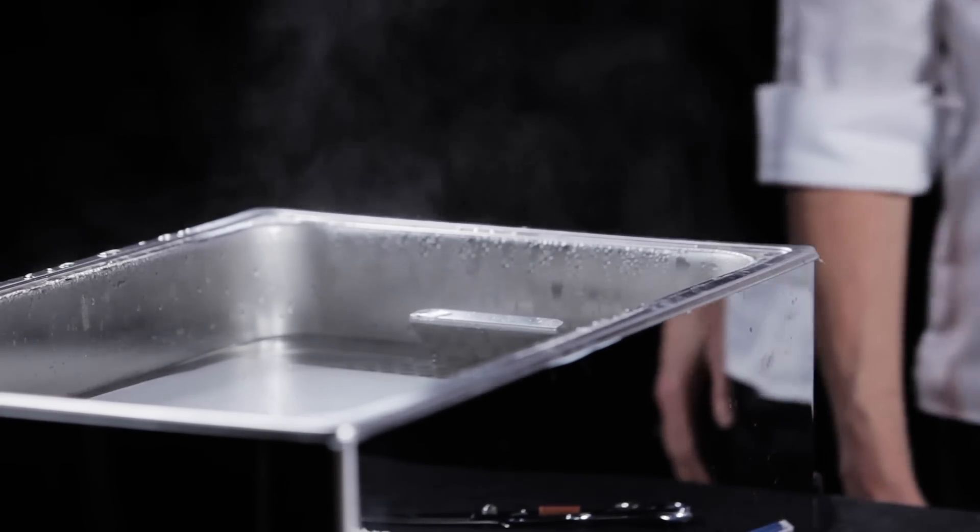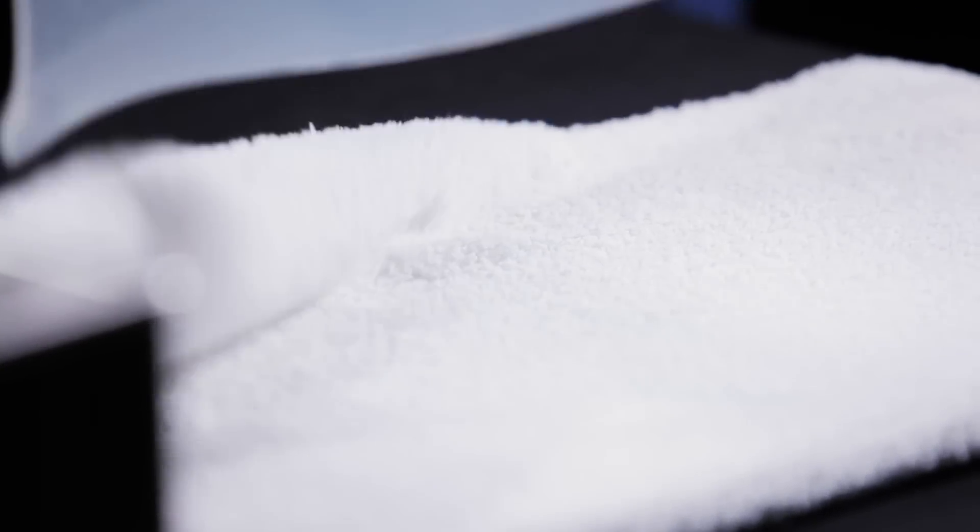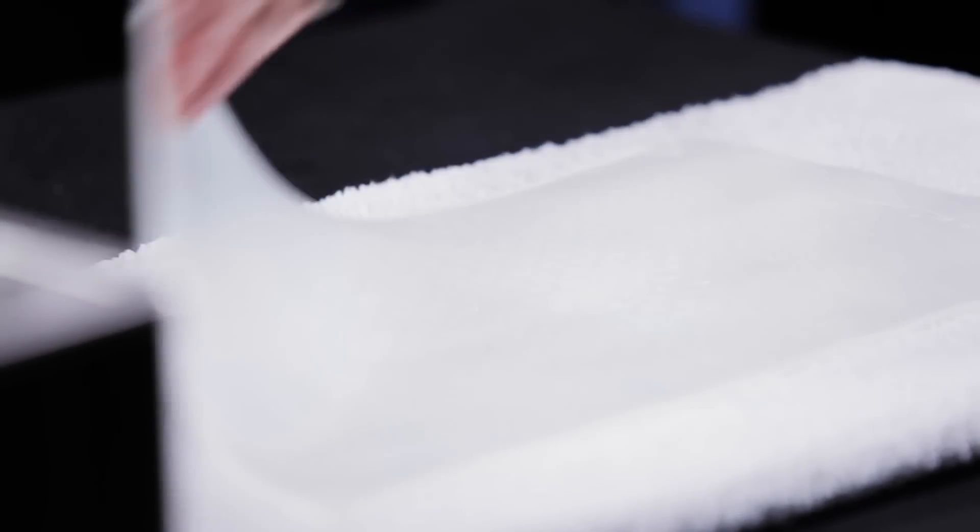Place the thermoplastic material in hot water at 65 degrees Celsius or 149 degrees Fahrenheit to activate. This material turns completely transparent when it's ready.